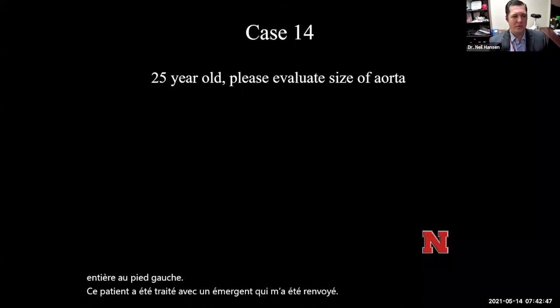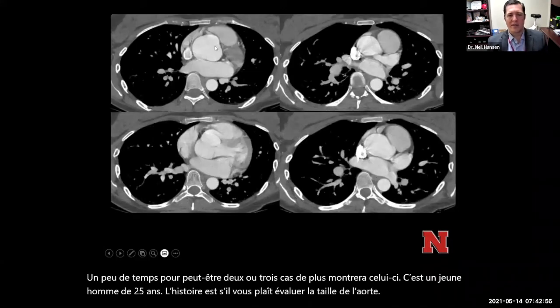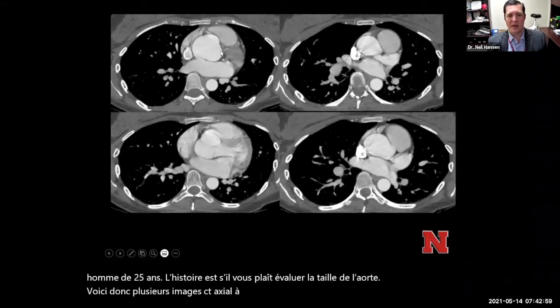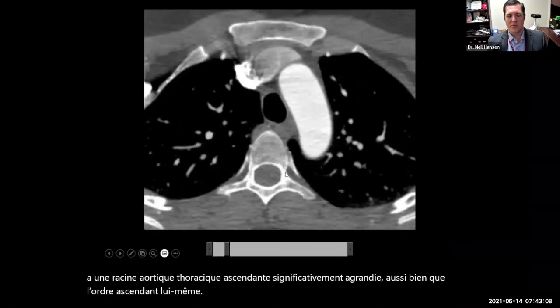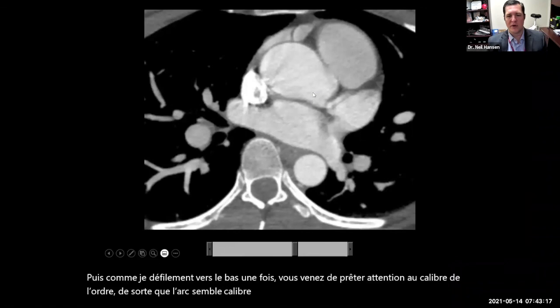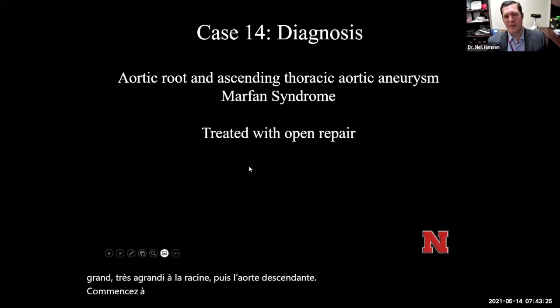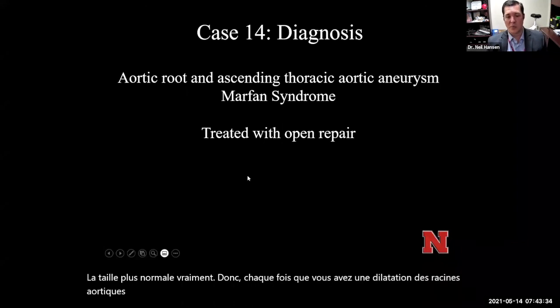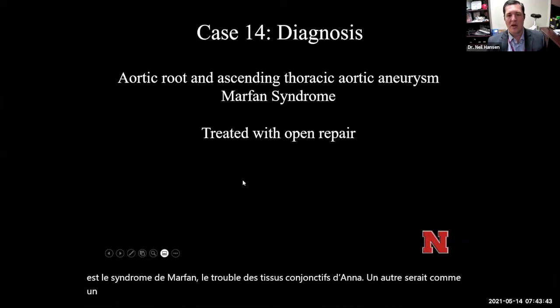The next case is a 25-year-old with the history: please evaluate the size of the aorta. On axial CT images through the aortic root, there's a significantly enlarged ascending thoracic aortic root, as well as the ascending aorta itself. The arch looks relatively normal caliber, the ascending aorta is quite large and very enlarged at the root, and then the descending aorta returns to more normal size. Anytime you have aortic root dilation and ascending thoracic dilation, you have to think about Marfan syndrome or other connective tissue disorders, as well as a bicuspid aortic valve or severe aortic valve stenosis. In this case it was Marfan syndrome, treated with an open repair.